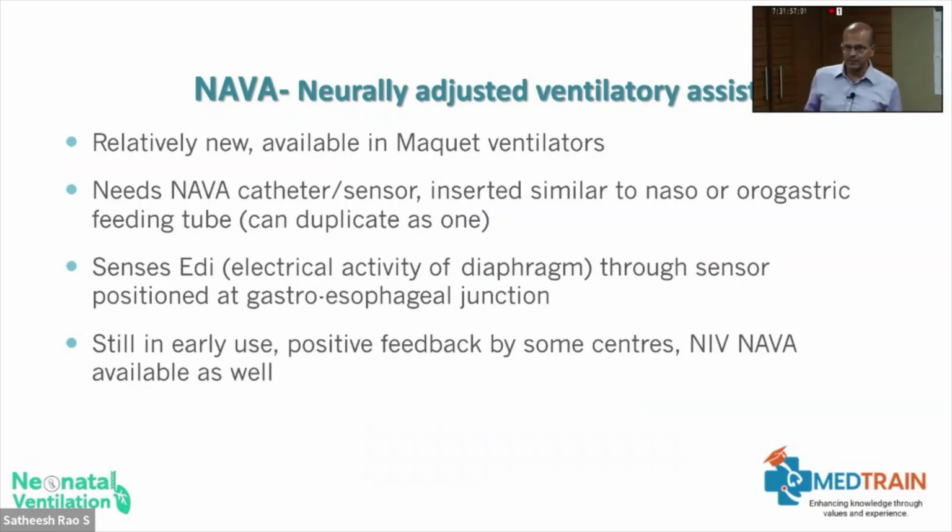It's well studied now, but unfortunately, because it's limited by the ventilator, not as much research evidence is coming up. And even within units that have the Maquet, not everyone uses NAVA. So I went to Toledo, Dr. Howard Stein's unit, to review this because we had a Maquet ventilator in my previous place. Even in his unit, some colleagues are not using NAVA.